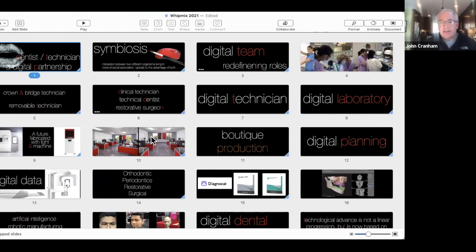Yeah, so we're going to be talking about digital denture workflows today. And again, just as an aside, this is probably the area with digital workflows that I've been maybe most focused on over the last, I don't know, maybe 6 months with Lee and learning different ways. We started with immediate dentures primarily because it's just a great way to start when you're working towards all on 4, all on 5. So, getting the teeth out, getting a denture in, maybe loading it or not, that was the workflow we started with.